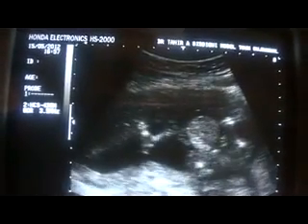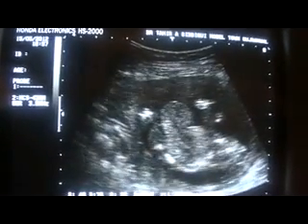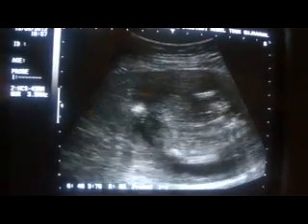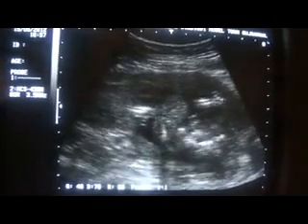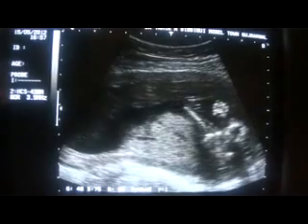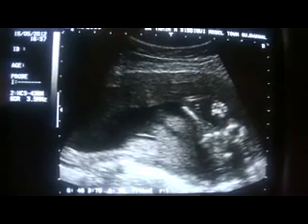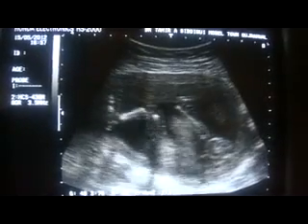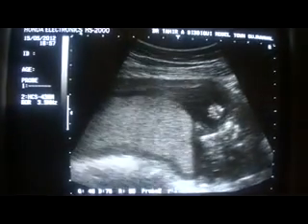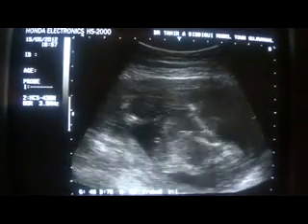What we see is, we try to get the fetus in its total length, body of the fetus. Then this is the measurement.